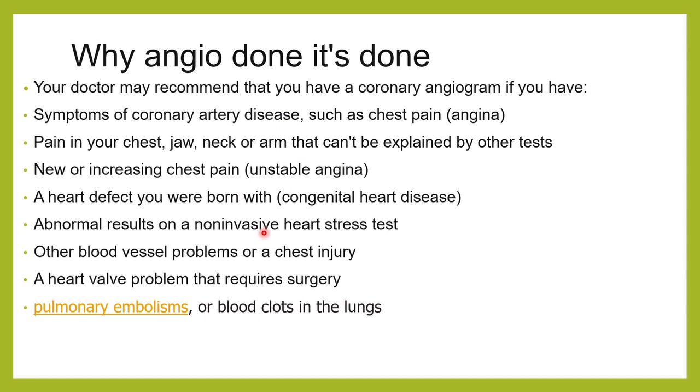Suppose the patient has a newly detected chest pain, or there is a chest pain which is increasing, then also the doctor will advise an angiogram.